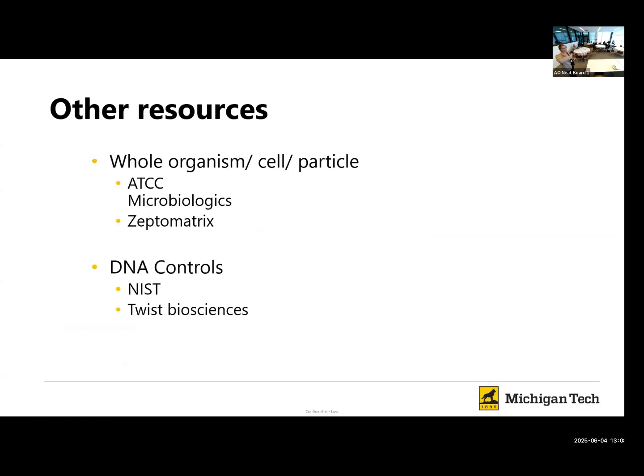Okay, so other resources I wanted to highlight are things like a whole organism, cell, or particle. So ATCC, Microbiologics, Zeptometrics, NIST. I'm sure the list is endless. I've worked with different people who are trying to make either inactivated viruses or inactivated particles that you can spike in to really test your workflow for just a new target.